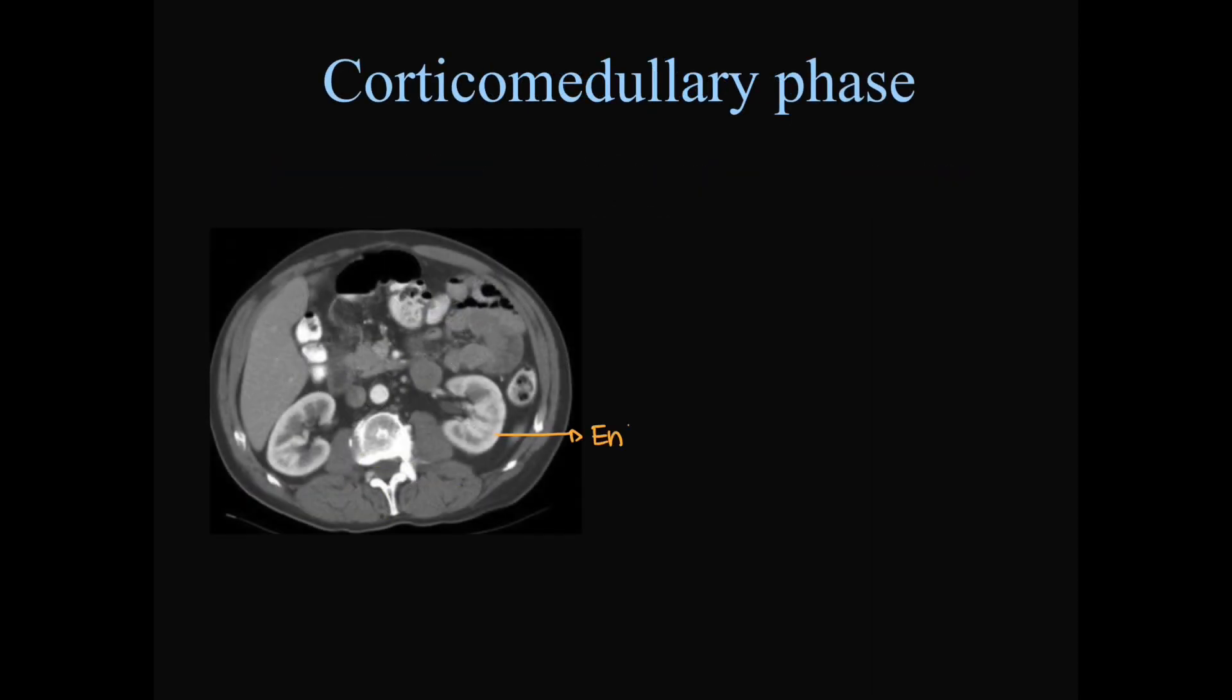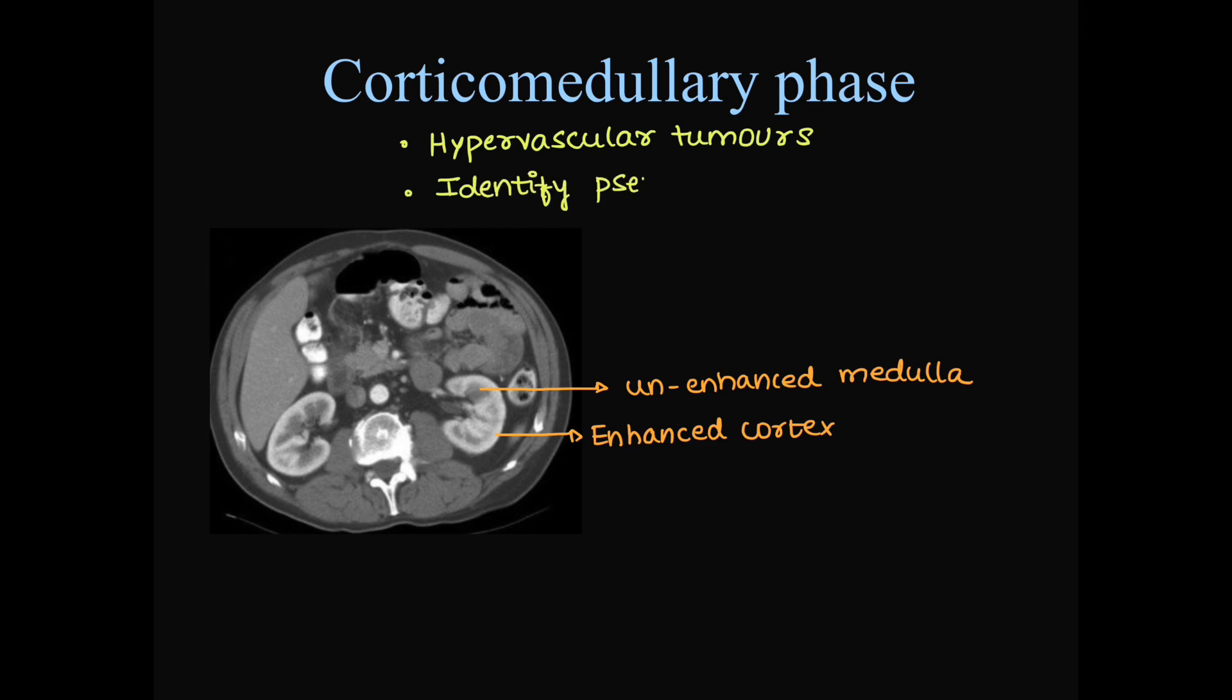Let's see each phase in detail. This is how the corticomedullary phase looks like. There is enhanced cortex, unenhanced medulla. Hence, they can be very well differentiated from each other. Also, vascular structures are seen and hypervascular tumors can be identified. We can identify pseudotumors or normal variants of the renal parenchyma. Also, we can see tumor extension into renal veins in this phase.